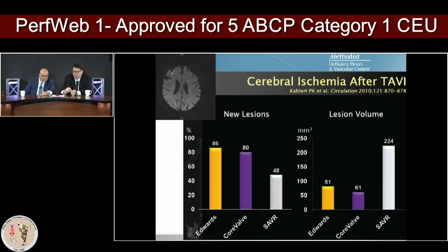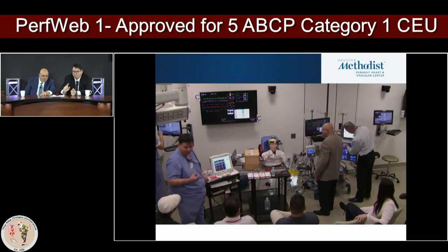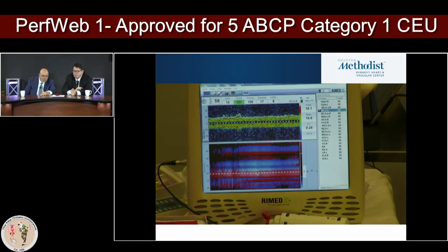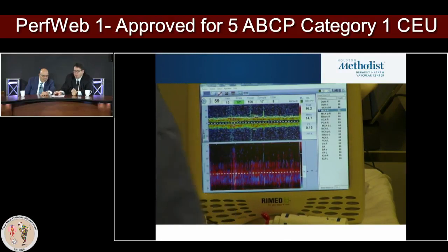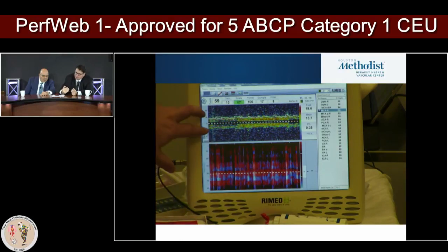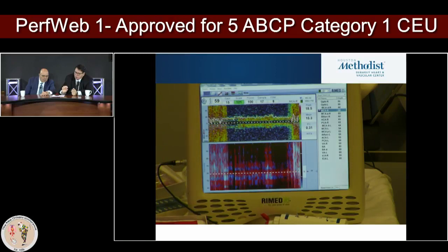So I want you to watch the TCD screen, the upper one, and listen to our conversation, because we recorded that. Stop the pump so I can see that there's air. Good. That's it. So don't hit that again.